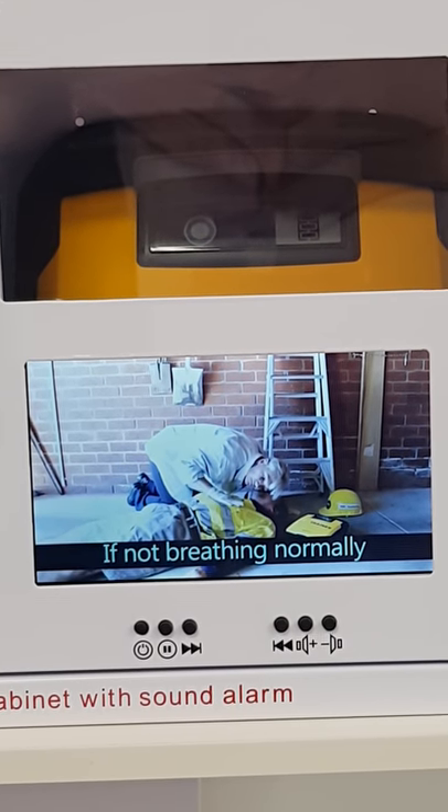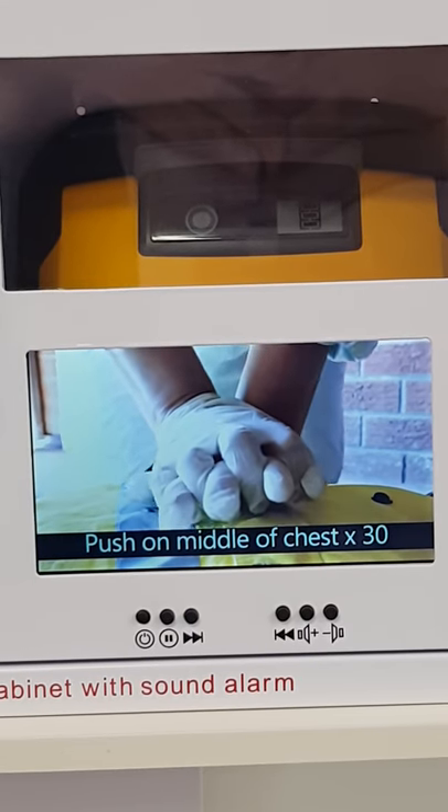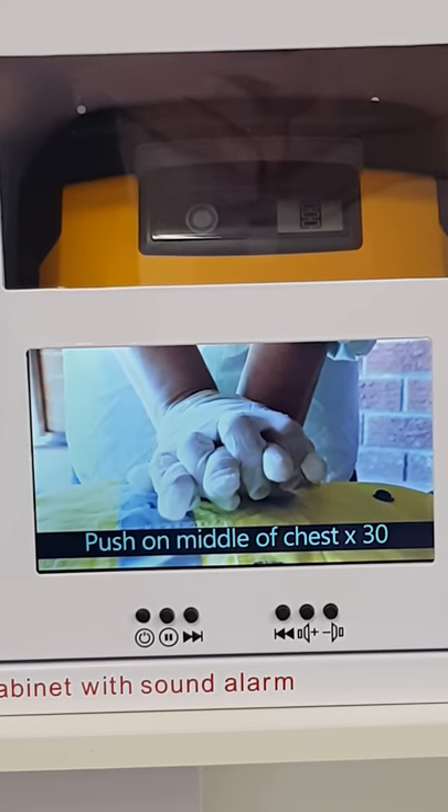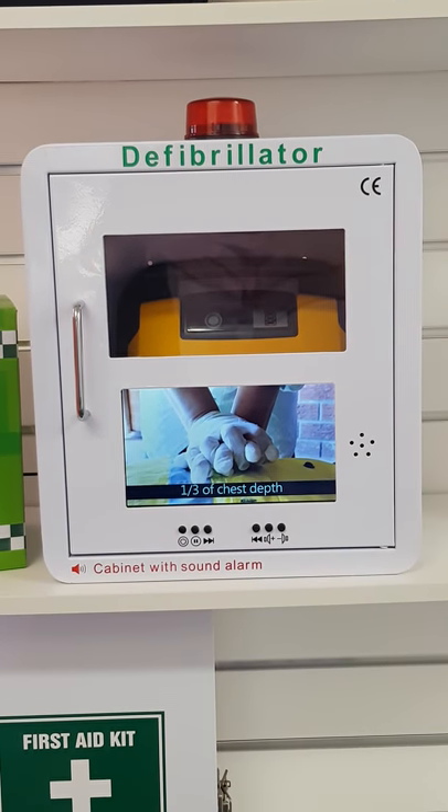If the person is not breathing normally and not responding, commence CPR. Push up and down on the middle of the chest 30 times, one-third of the chest depth as shown.